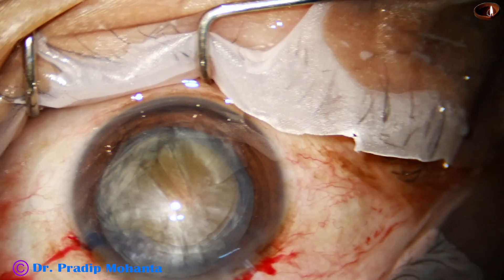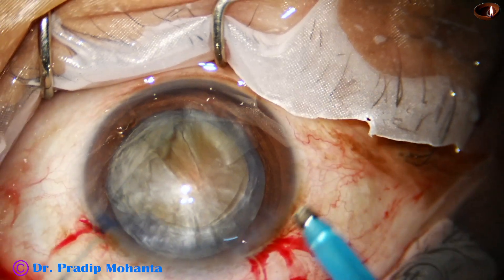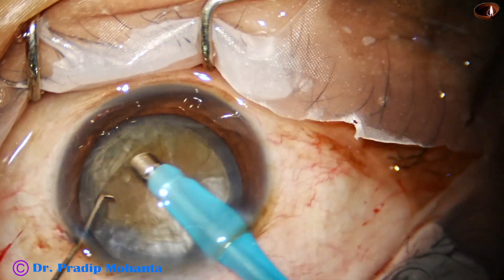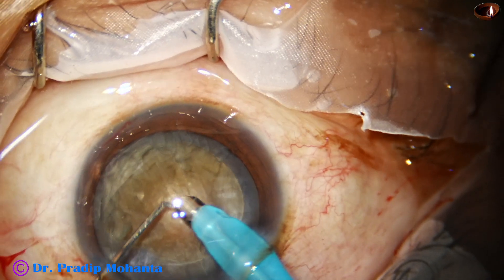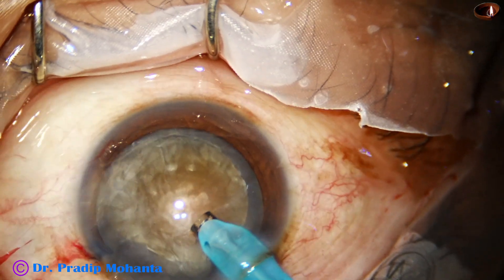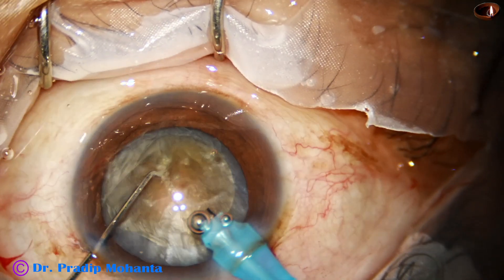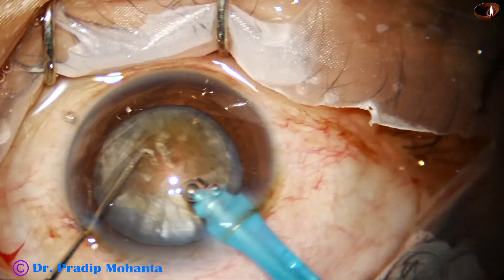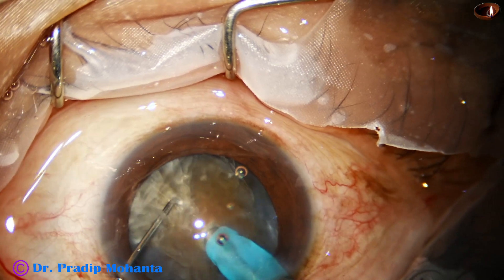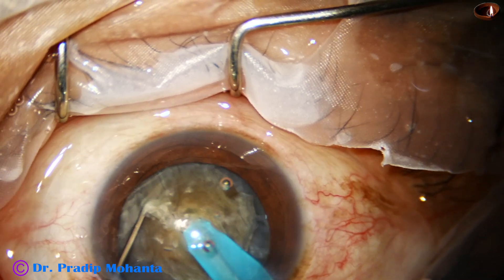Now, hydrodissection is done and the nucleus is tapped. The phaco handpiece — the phaco needle — is introduced with its bevel down. Some superficial cortical lens matter is removed. I am now trying my technique, the submarine chop technique. The tip is buried into the substance of the nucleus and goes through it like a submarine through water, traveling towards the posterior equator and stopping at the end of the hard part.